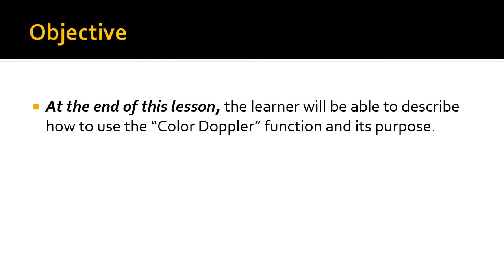We're going to talk about the color Doppler function, and this is another basic function that we can use to actually get some diagnostic information.